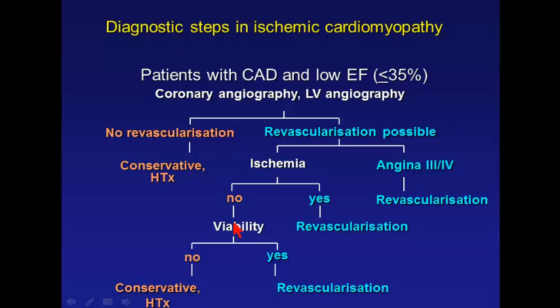Just for the understanding, we do viability testing, and we do it generally with FDG, and I would like to show you here a little bit of also the advantages of one over the other technique, without favoring one or the other, but there are reasons why we should know about both.